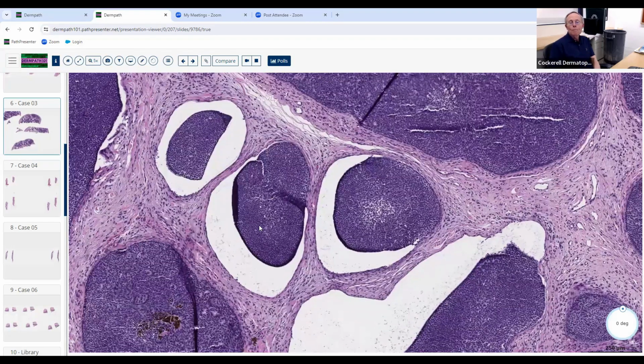And one clue to the diagnosis of basal cell carcinoma itself is clefting between the epithelium and the stroma. Now, there's a difference between a criterion for diagnosis and a clue to the diagnosis. A criterion is a feature of the lesion that you put together with others to make a definitive diagnosis. Those are things like cell type, breadth, symmetry, circumscription. Those are the criteria that we use to decide whether something's benign or malignant. A clue is something that's helpful if it's present, but it's not required for the diagnosis.